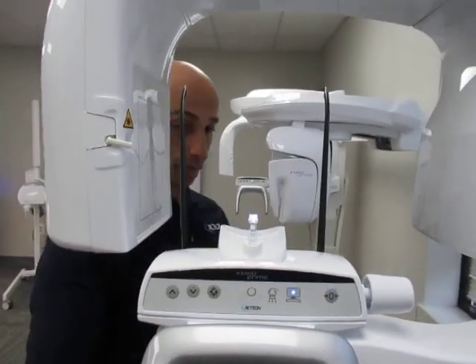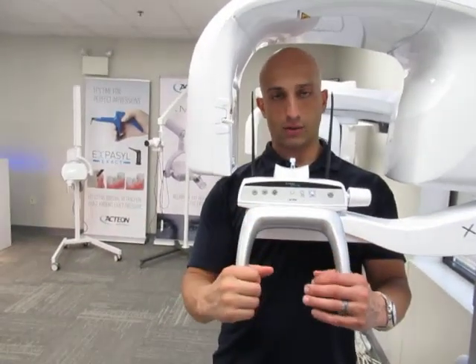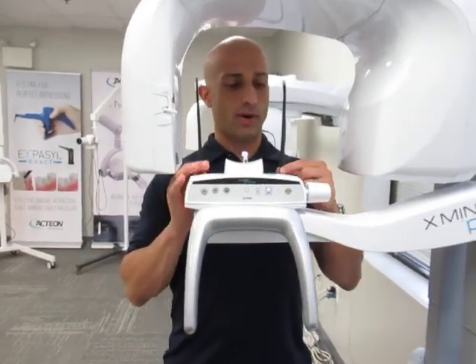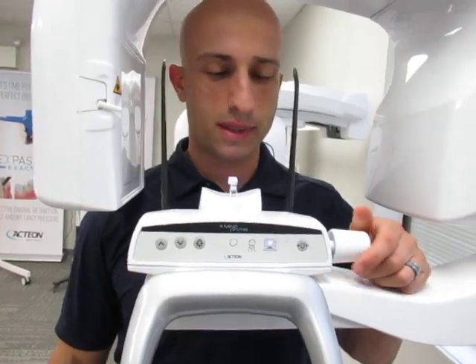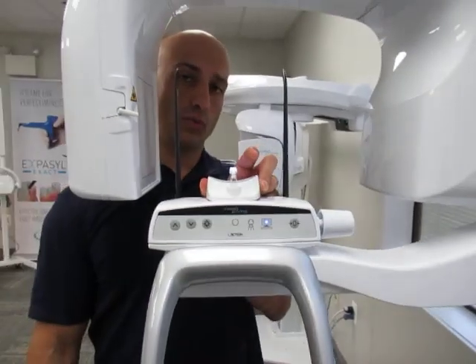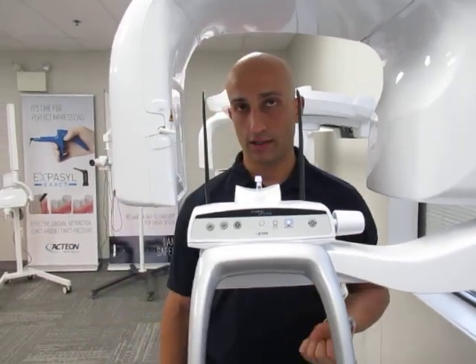The patients will be standing where I am here. They're going to be grabbing these gray handlebars, which are infused with a silver resin so they have antimicrobial properties. You have right here the temple support rods, and the adjustment knob is right next to it. And then you have various chin rests, which we'll go over in another video, to use depending on the modality you've selected.